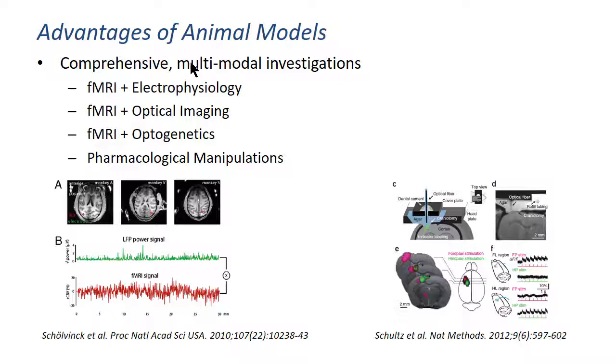And that means that we can marry the many advantages of the non-invasive MRI technology with more invasive technologies like electrophysiology or optical imaging that requires direct visual access or optically clear access to the brain.